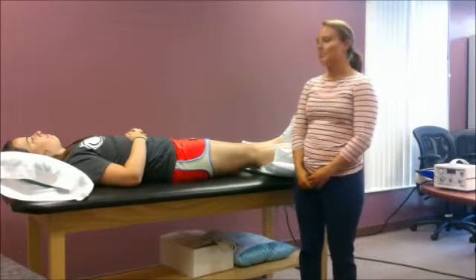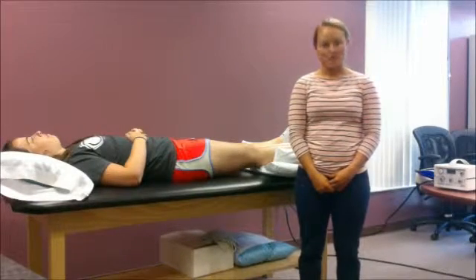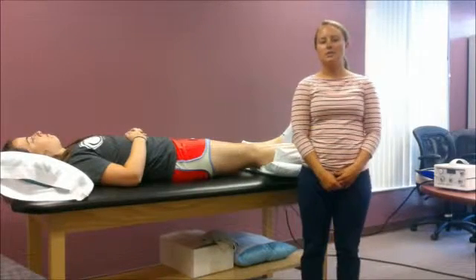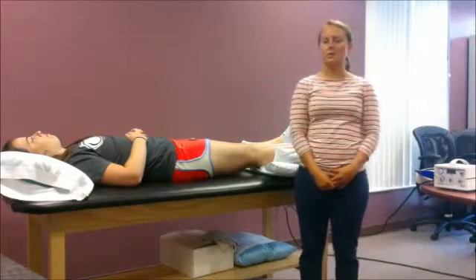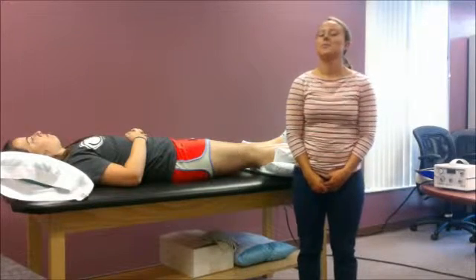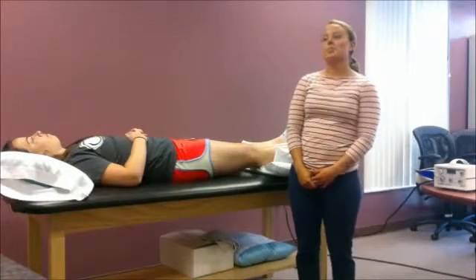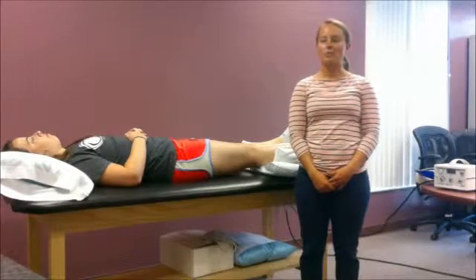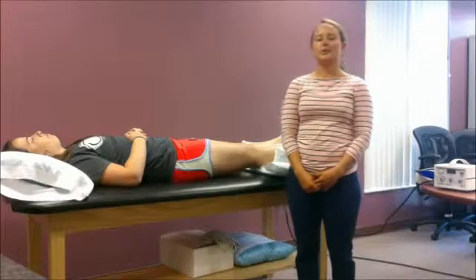Before treatment, I'm going to clear for contraindications and precautions such as heart failure, a recent or acute DVT, thrombophlebitis, pulmonary embolism, obstructed lymphatic or venous return, peripheral artery disease, skin infection, hypoproteinemia, or acute fracture or trauma.